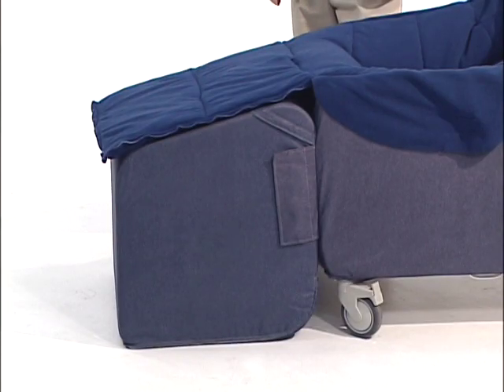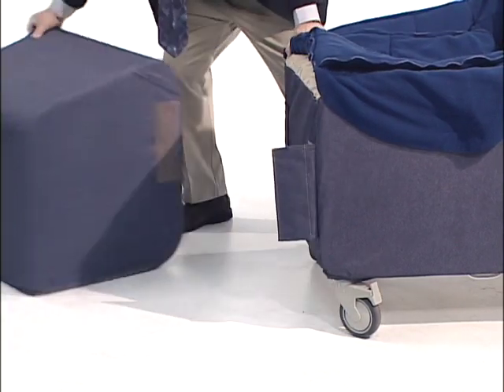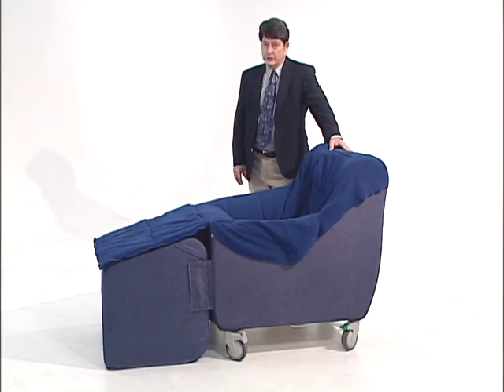The removable ottoman facilitates resident entry and exit. The CareFoam two-piece chair is the chair of choice when you have determined, through your own internal policy and procedure, that an intervention for safety is necessary.